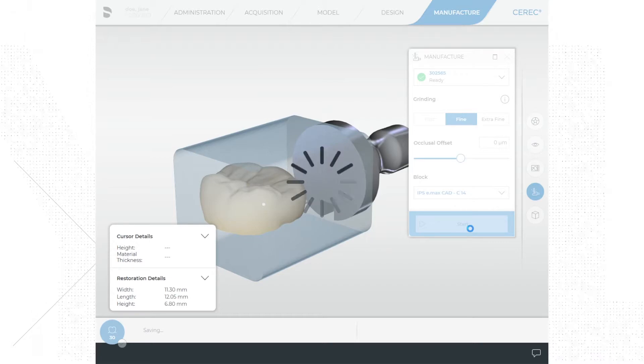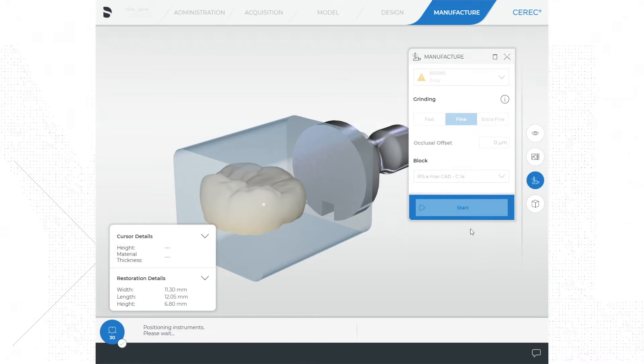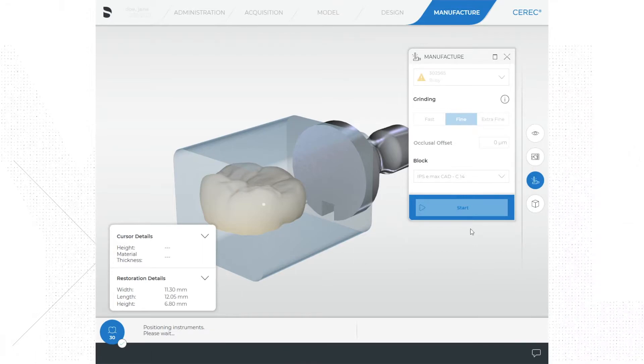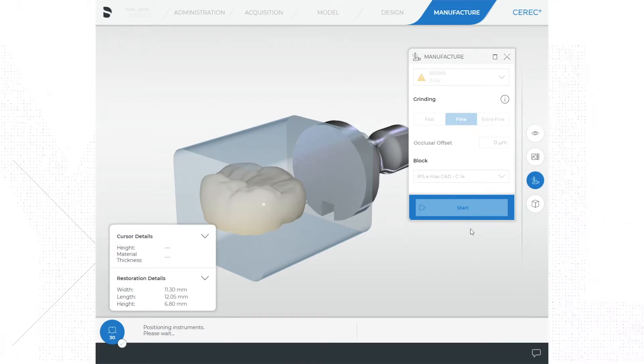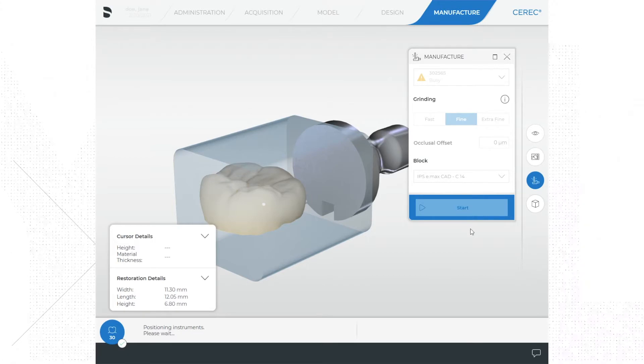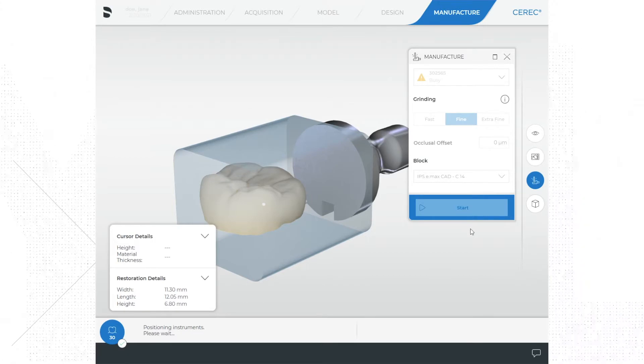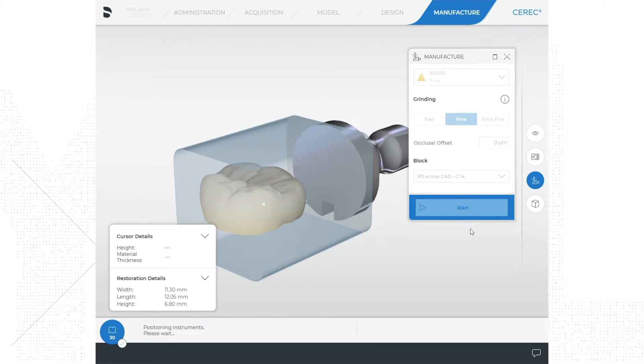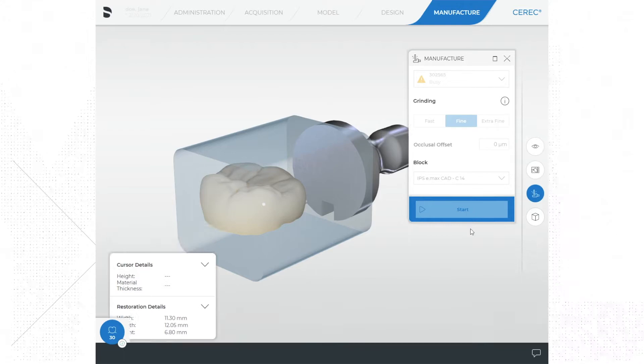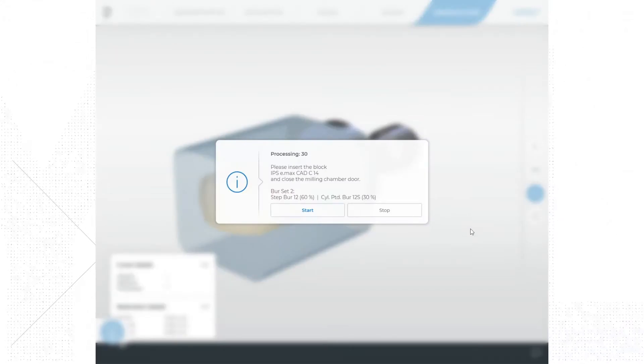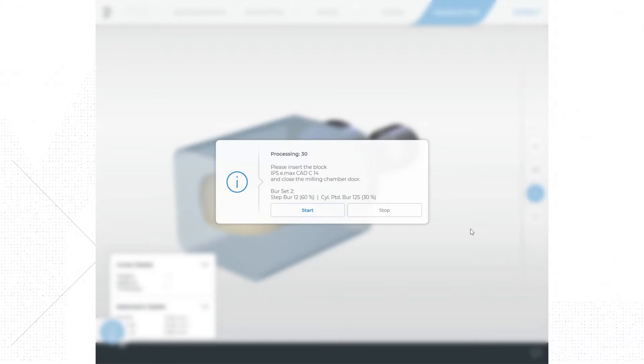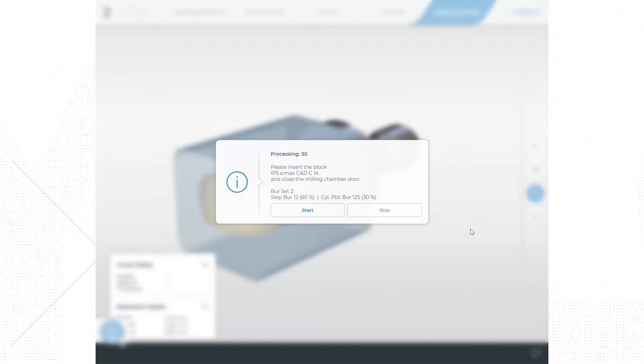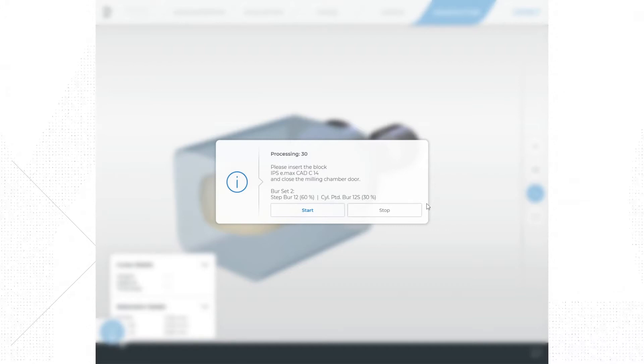All right, so after you hit the start button, what's going to happen is the system starts to process what you're asking it to do, and one of the things that's going to happen is we're going to see a little window pop up here in one second. So now the milling machine down the hall is actually positioning the instruments or positioning the burrs, and now we're seeing a window that pops up. So this happens every time you go to mill.